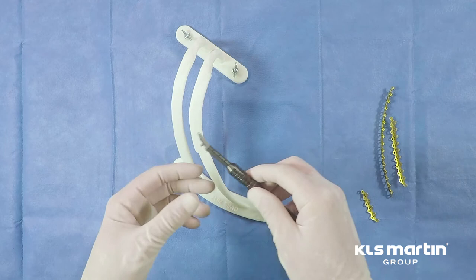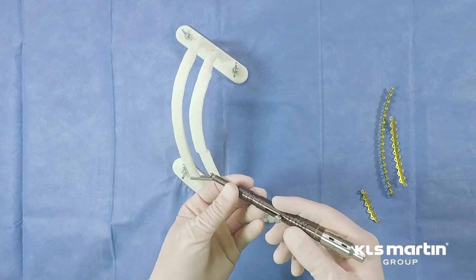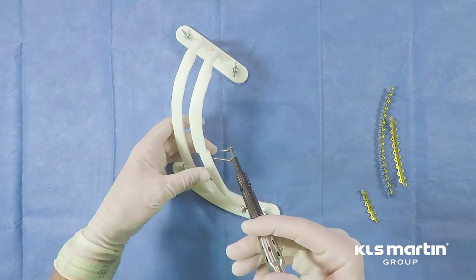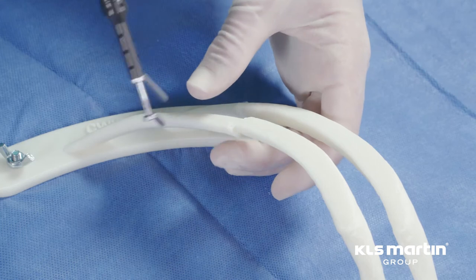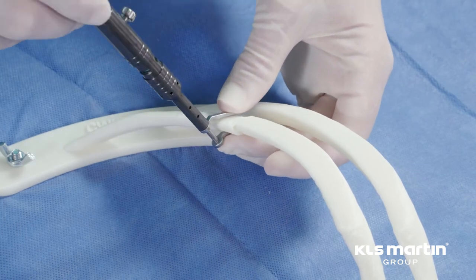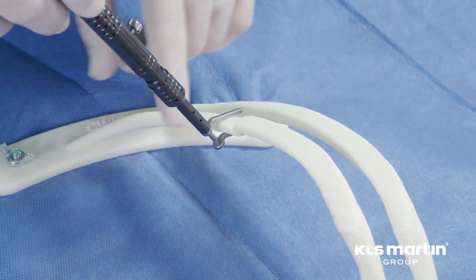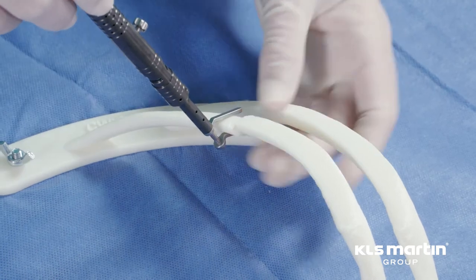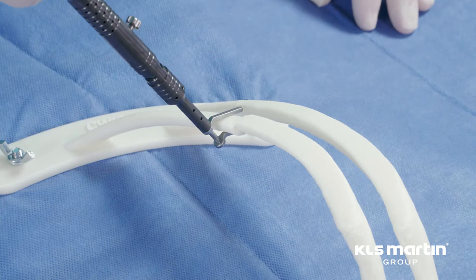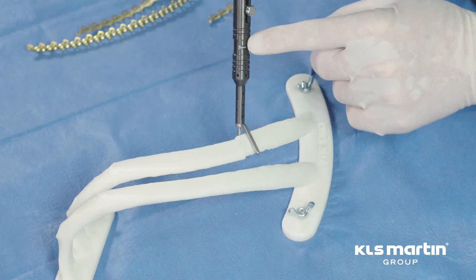It's advised that one should measure the rib thickness. That can be fairly simply done with this caliper device, sliding one jaw below the rib through the intercostal muscle and applying it thusly. If the rib thickness is greater than 6.5 or 7 millimeters, then it's safe to use the 7-millimeter screws, and the proper thickness will be indicated in this green bar right here.